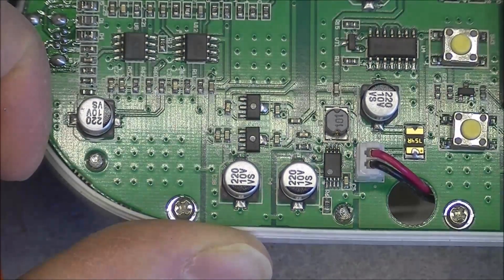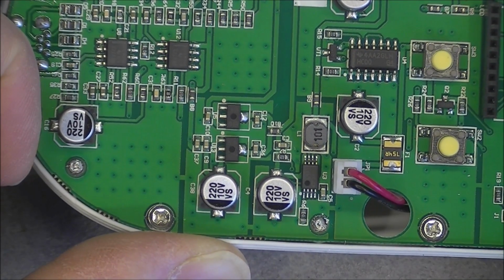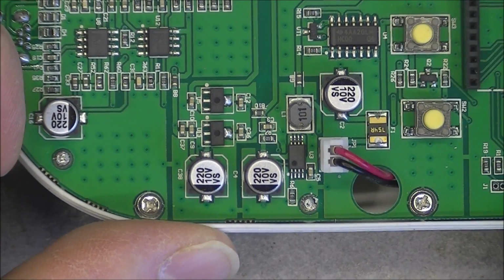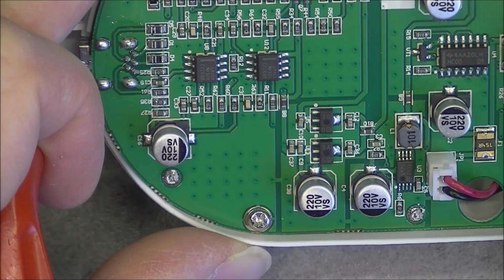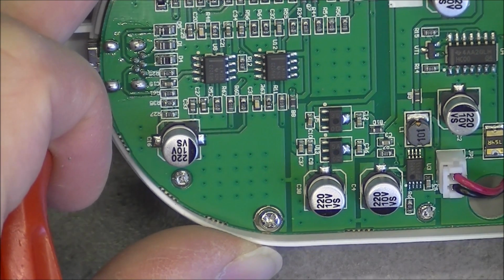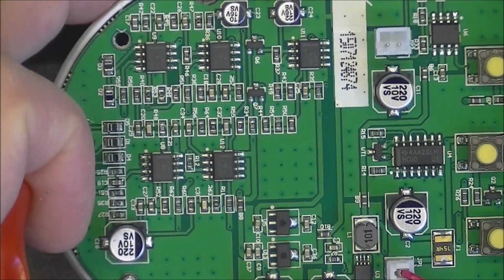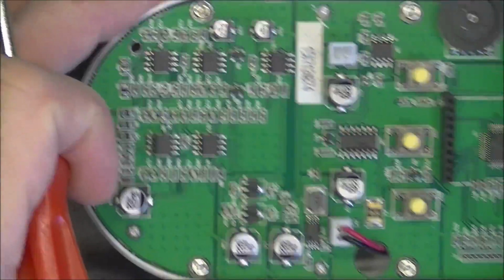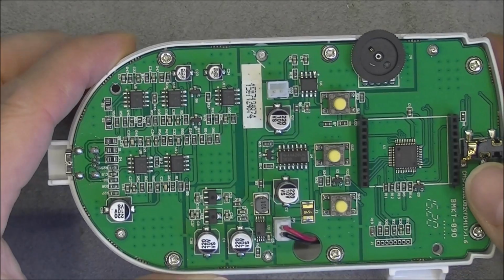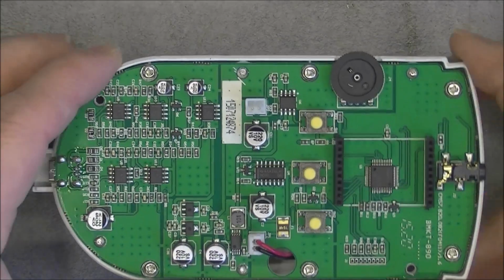A few more power transistors here, probably for the power supply needs. So if there really is an ultrasound transducer in this, yes, probably you need to generate some kind of high voltage, but maybe not in here, because I can see all the capacitors are rated 10 volts. So it is probably not made in here. And I know already there is nothing at all on the other side of the PCB, so it is not even worth the time removing it.